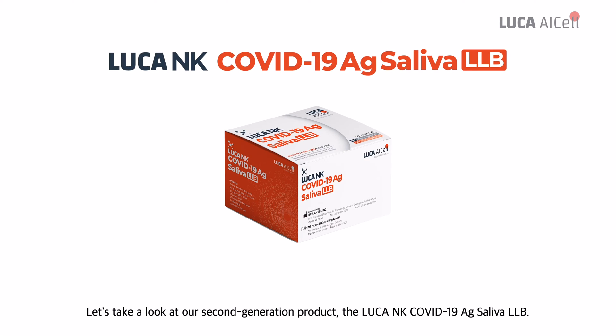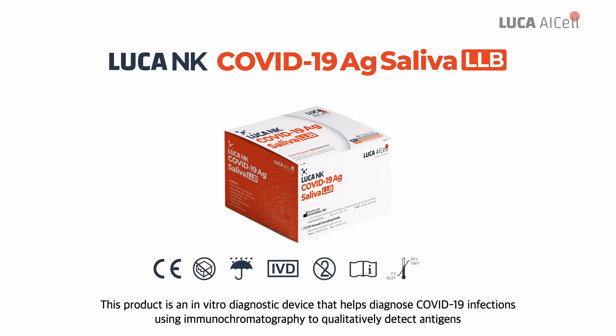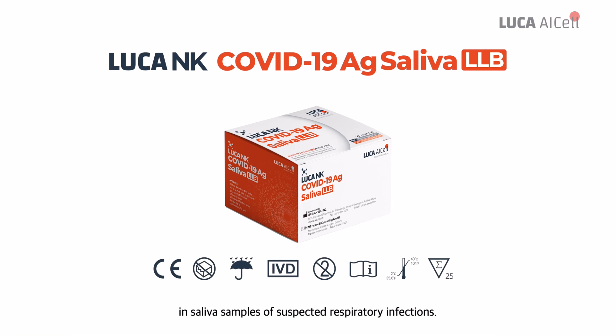Let's take a look at our second generation product, the Luca NK COVID-19 AG Saliva LLB. This product is an in vitro diagnostic device that helps diagnose COVID-19 infections using immunochromatography to qualitatively detect antigens in saliva samples of suspected respiratory infections.